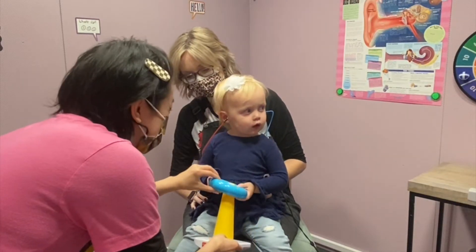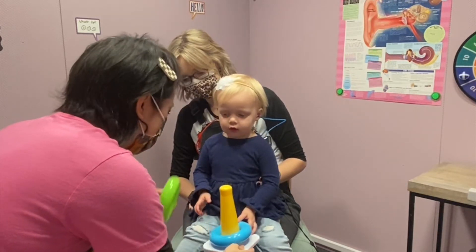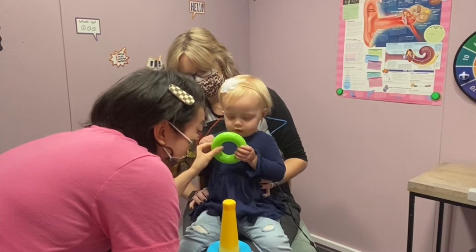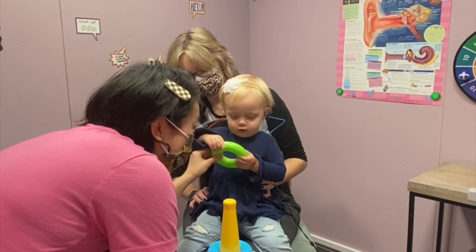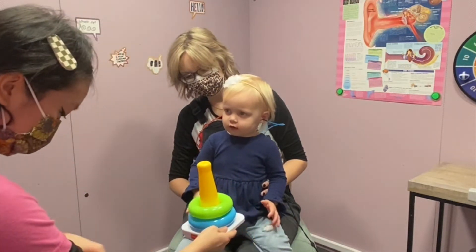We begin training a child how to do conditioned play audiometry by obtaining a speech awareness threshold. You can see this young child wearing insert earphones, holding a ring up to her ear. The audiologist says a phrase, 'put it on,' and we teach her to put the ring on when she hears her voice.